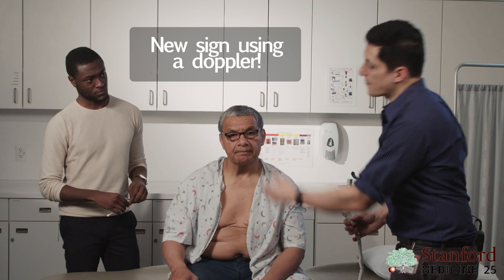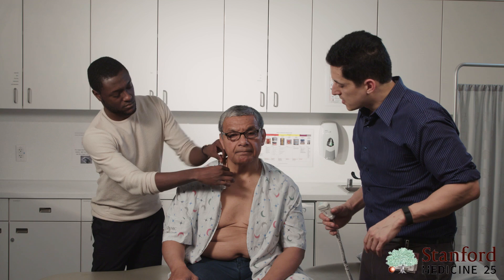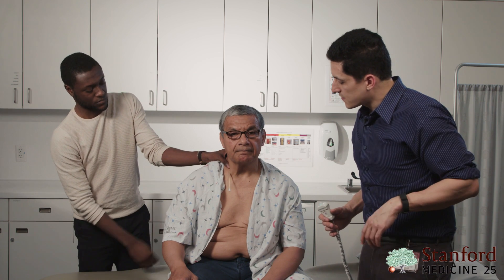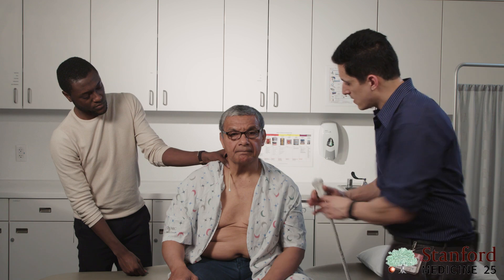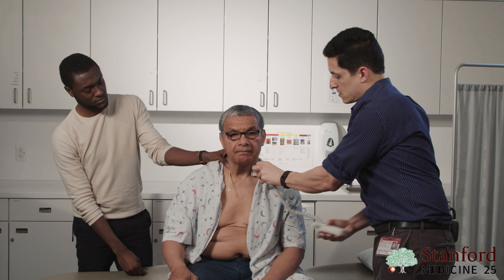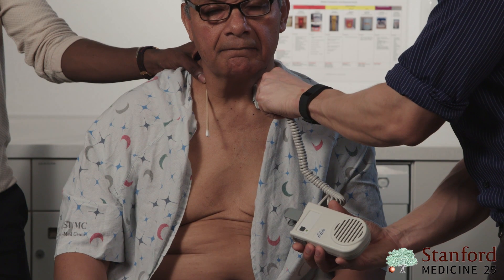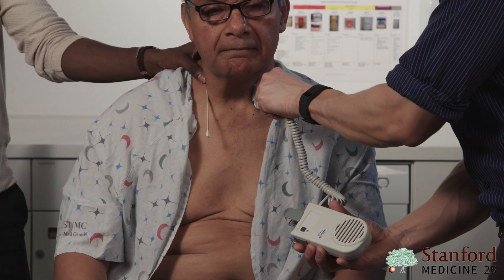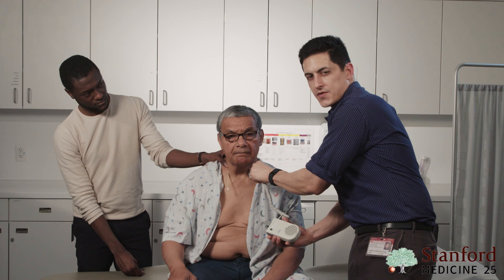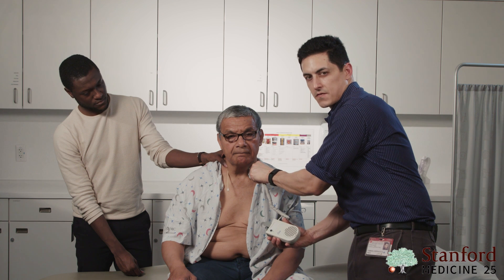All you simply do here — I have Balfour here who's going to help me demonstrate this. Balfour's going to show the contraction of the artery using this stick. You can see the contractions of the artery, and then we'll go ahead and put the Doppler over his other carotid artery. We're taking a Doppler, placing it over the carotid artery and tilting it downward a little bit. After you hear the systolic component, you hear a diastolic reflux of blood flow back towards the heart.